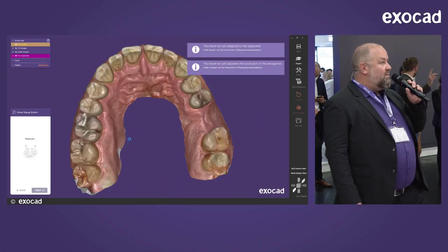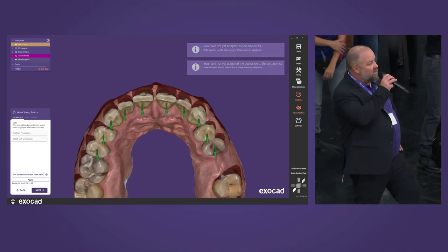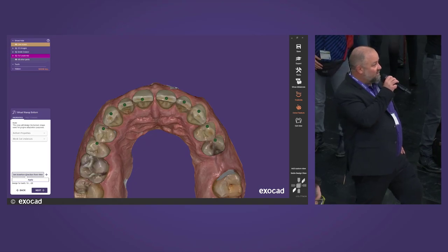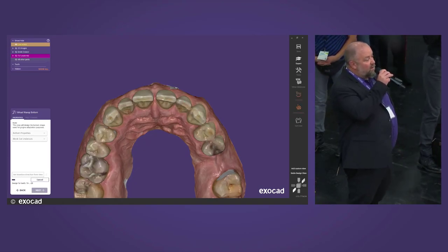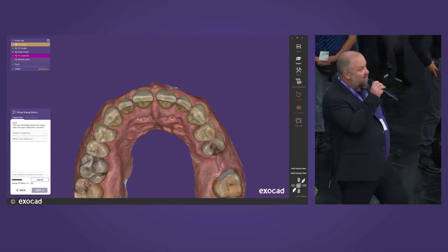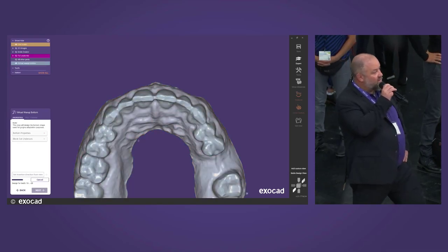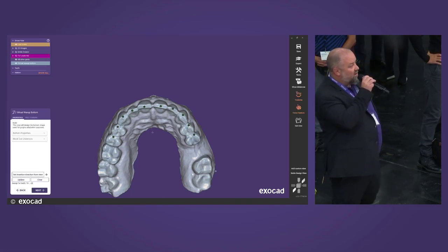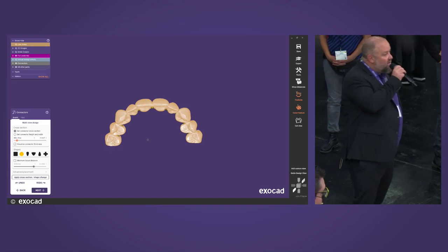We can proceed to the next step — insertion. Even such a small structure needs an insertion direction defined. We try to avoid deep undercuts especially on the cervical areas. The software then does the block-out automatically, with different parameters available: you can choose an offset or define a specific undercut depth.